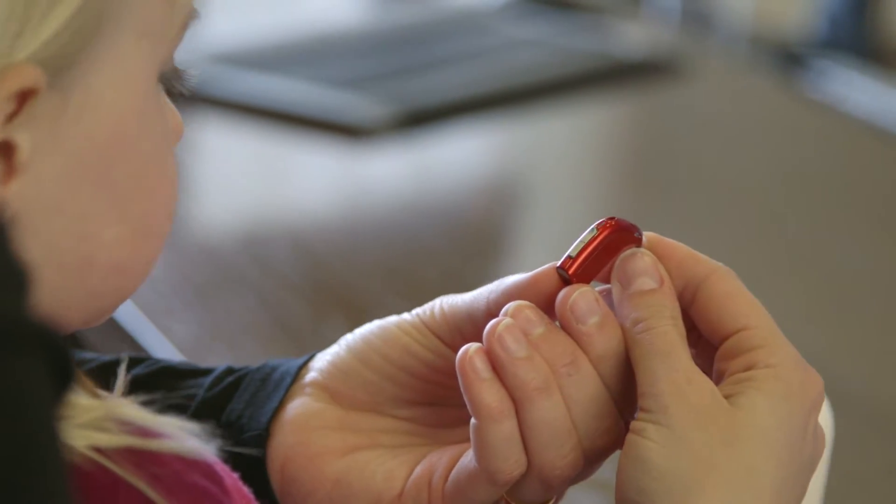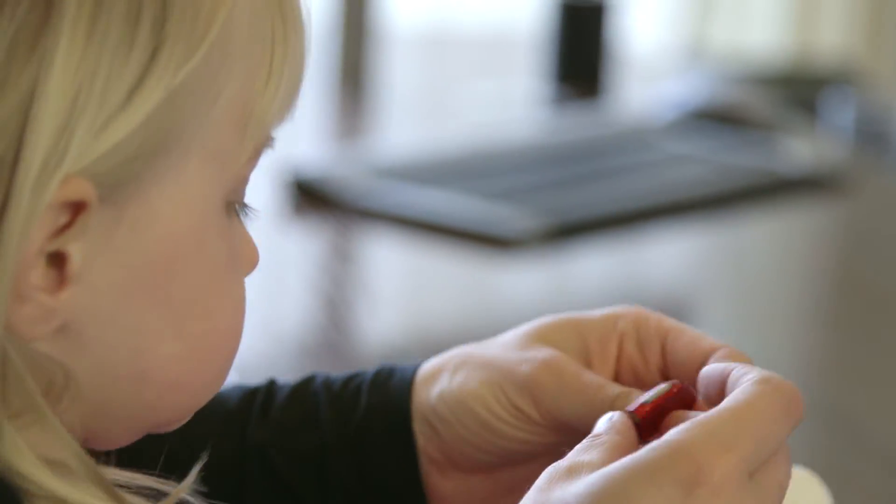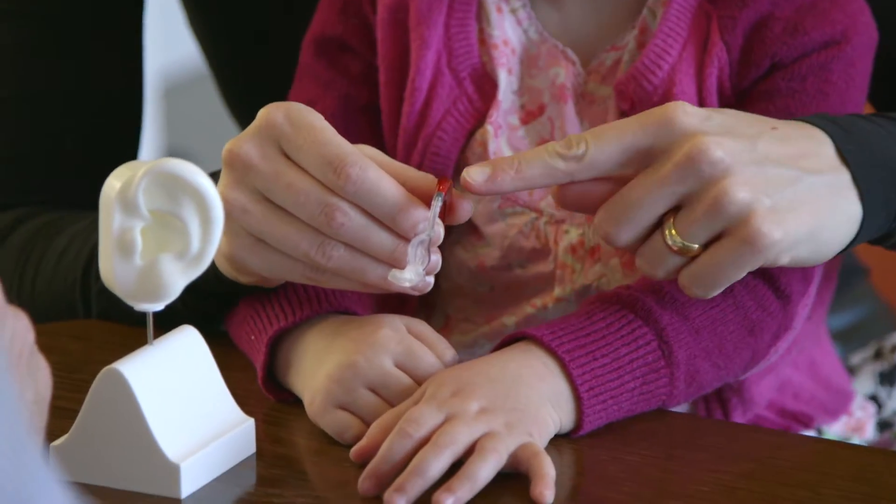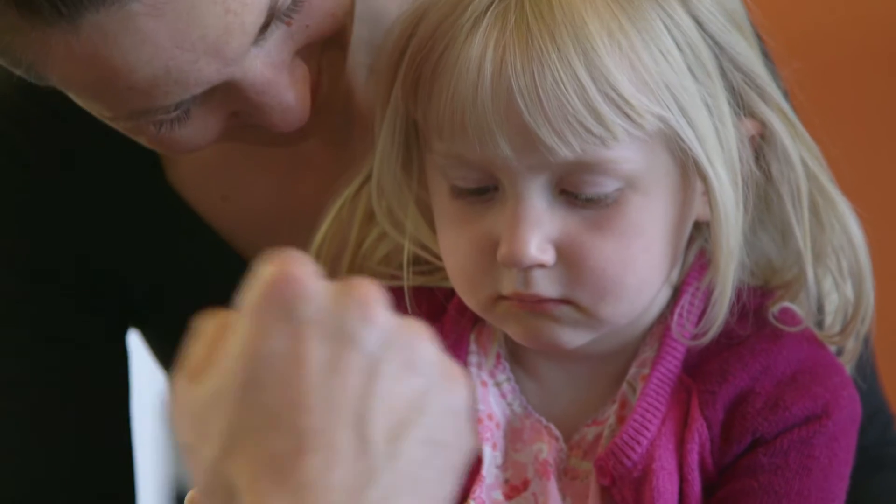Smart Fit Trainer can help with this process. Unique to Oticon, Smart Fit Trainer introduces a new dimension when showing parents how to insert ear moulds.